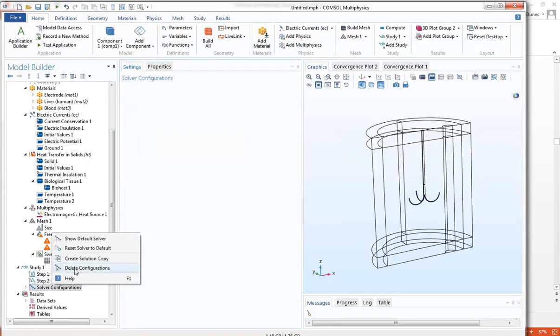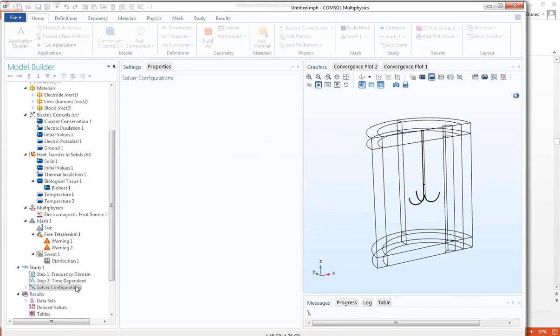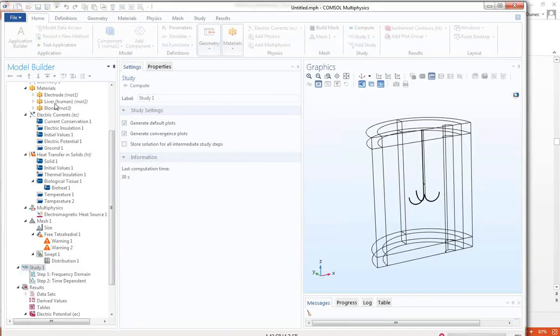Now, this is a little bit different, so let's right-click and change the solver configurations. I'm going to delete these configurations so that it knows. Then it's going to say, do you want to get rid of the results nodes? No, I want them. Then literally right-click and hit compute again. We'll end up with exactly the same answer, mainly because we are not having any permittivity.